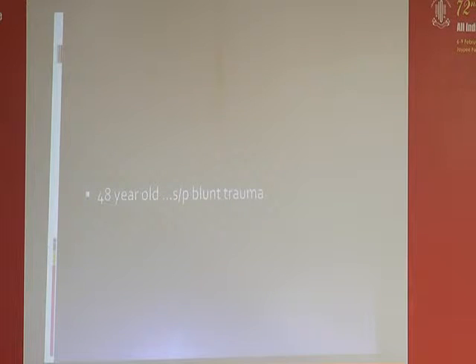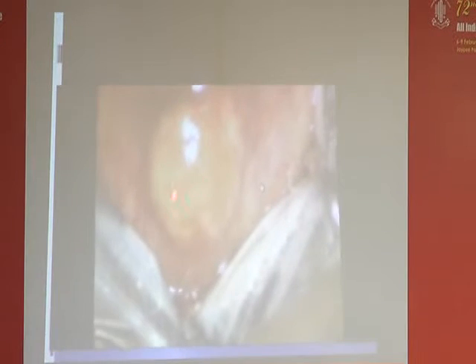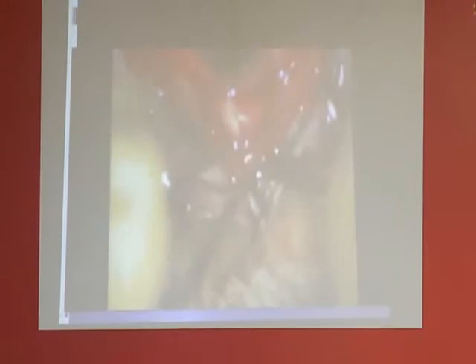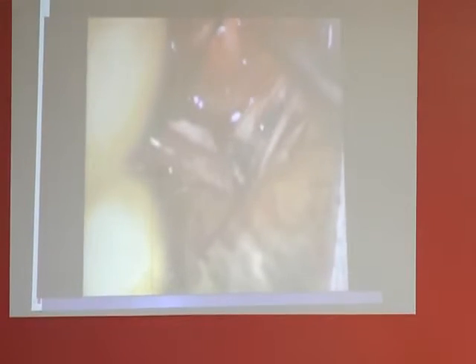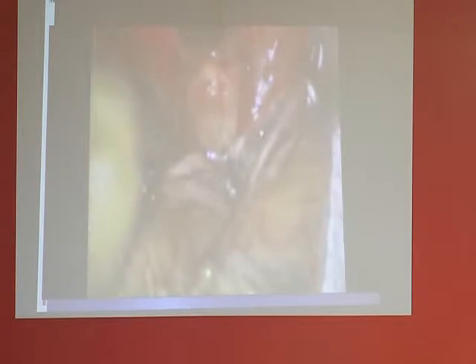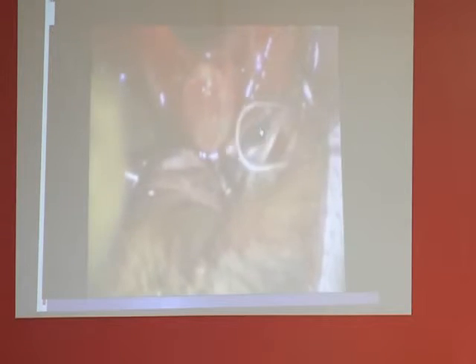Another case of an elderly gentleman who presented with trauma, and we have this cystic lesion just sitting above the superior limbus. In rare cases that we see, so again, in any posterior segment trauma, you first localize, open the conjunctiva nicely, dissect the Tenon's, look for the structure, what is that, and look also for associated injuries like scleral tear. So here basically it's a dislocated crystalline lens that we see, and the rest of the surgery was really easy, just taking out the lens.